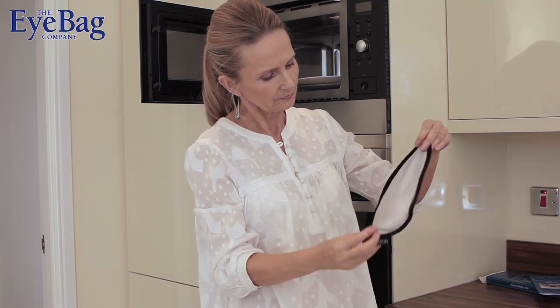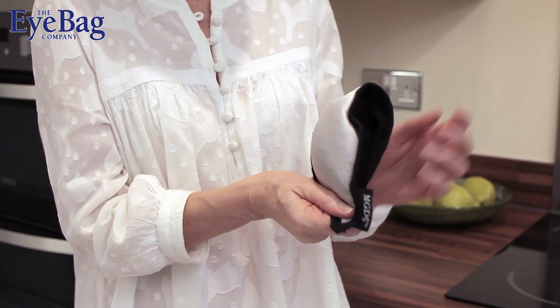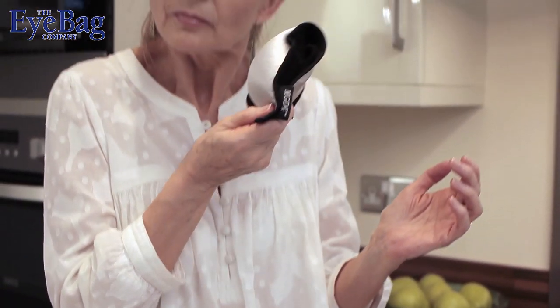It doesn't matter which side you use. Once you get used to the eye bag you'll soon have a preference. Test the temperature against your wrist and then cheek to make sure that it's comfortably warm. If it's too hot just wait a few moments and then check again.